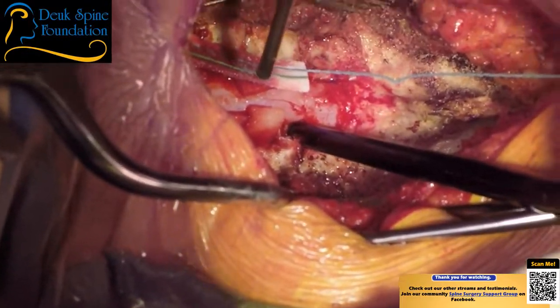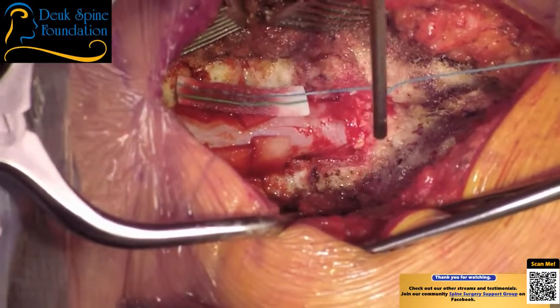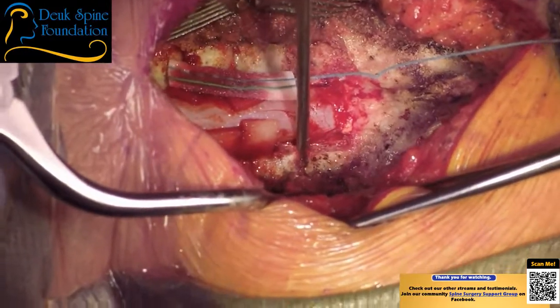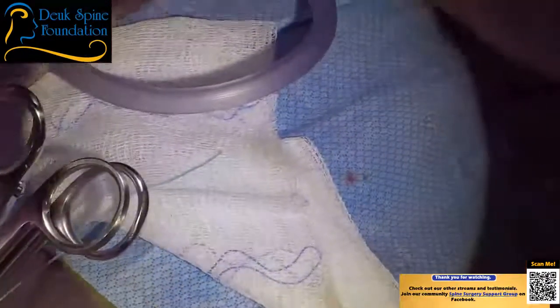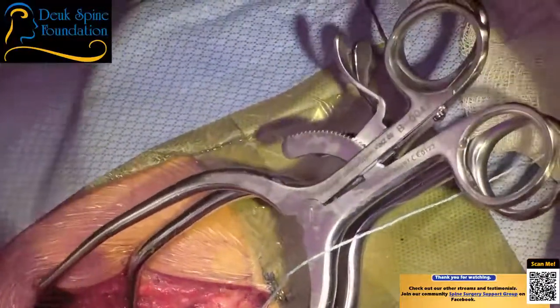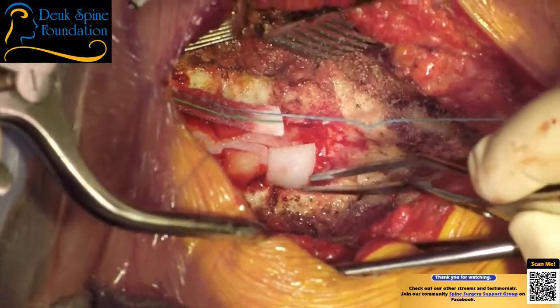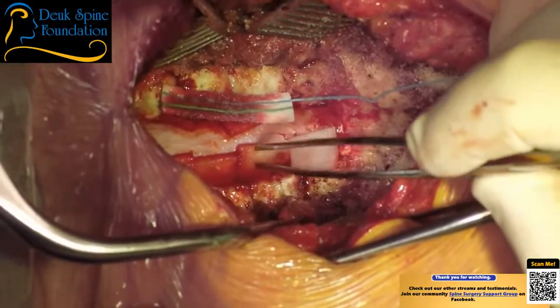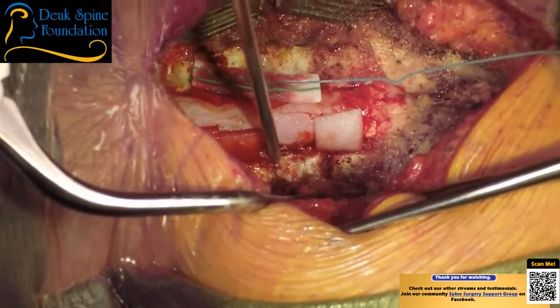And this is just arthritic stuff from the facet joint, gel foam. So I'm opening the foramen from the back. It's called the foramenotomy. And the surgery is called a laminectomy with foramenotomy. And we're doing this because she's got foraminal stenosis. She's not just a central stenosis patient. She's a foraminal stenosis.